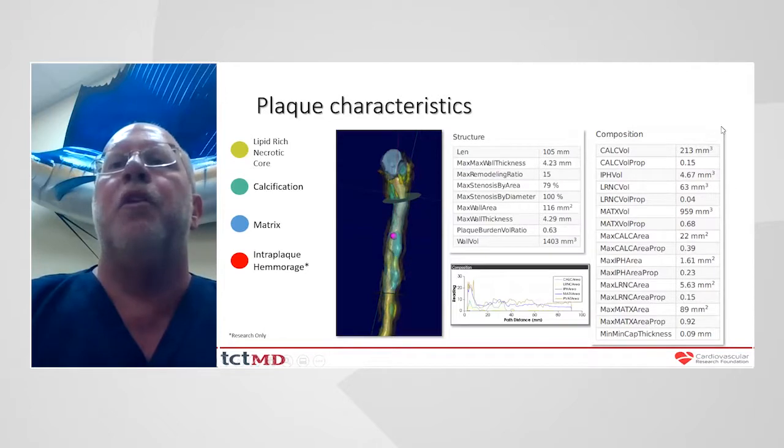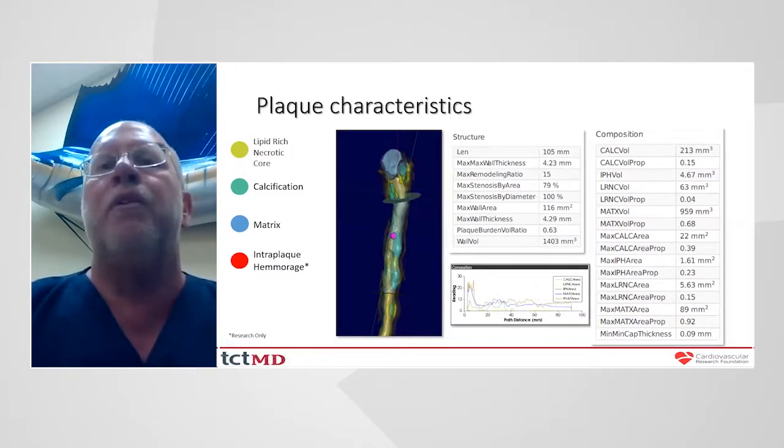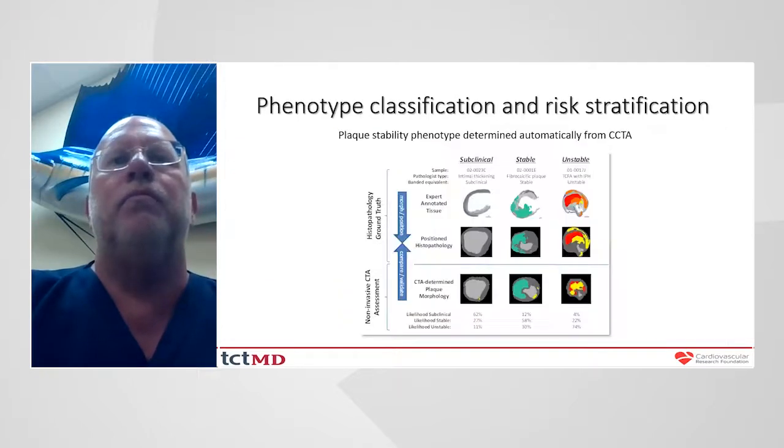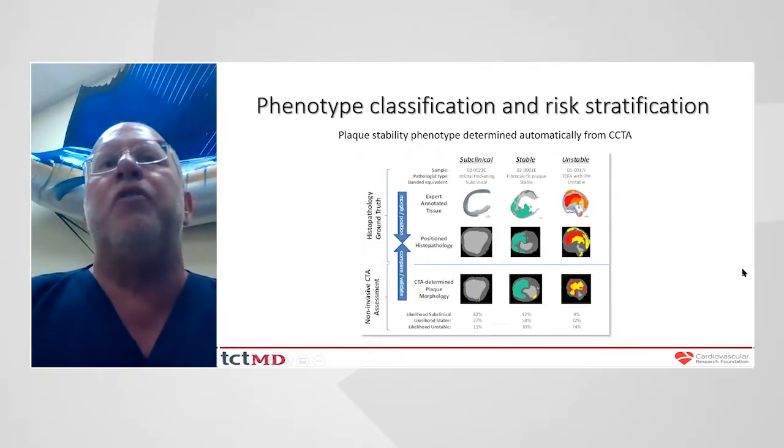And I think with this abundance of information, this software really lives up to Renu Vermani's stipulations. It gives you all the values that, as she said, are important in the evaluation of plaques and maximize the information and their predictive value. It actually gives you a likelihood ratio based on phenotype classification, giving you a risk based on what the plaque looks like with histology, with histopathology validation.